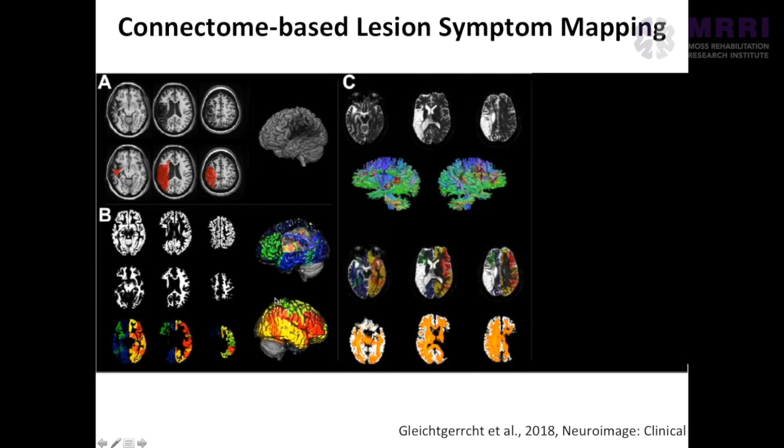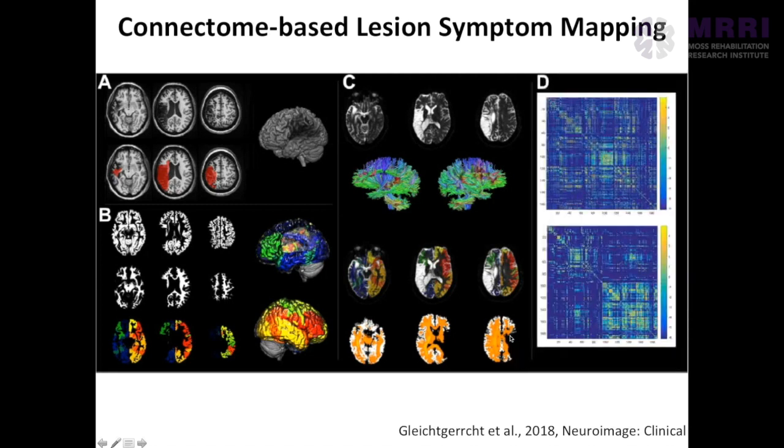And what this allows you to do is derive, using the separation of the gray and white matter from lesion, these kinds of masks here and apply them to your diffusion data. So then you can look at and inspect your white matter. Okay, so this is usually an FA map, fractional anisotropy. That's what you'll see here. And then what that allows you to do is, in your patient of interest, remove out the lesion and study the residual white matter connectivity. As you can see represented here, you can inspect the likelihood that any regions are connected after having removed out corruption in the signal from the stroke lesion.